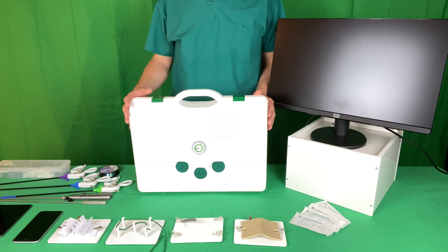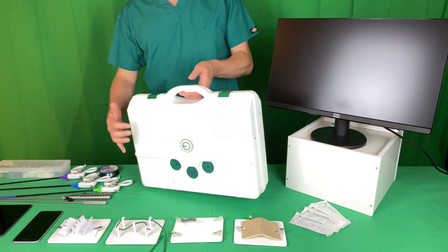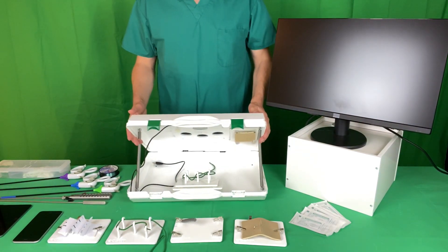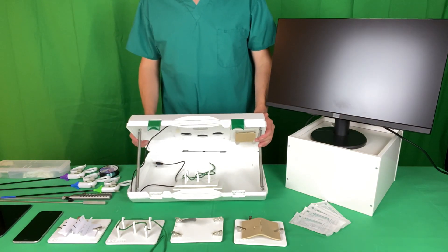EarSim is a compact and portable laparoscopic box trainer that opens by these latches here. Inside it you'll find all the disposables, practice models and instruments that you need.